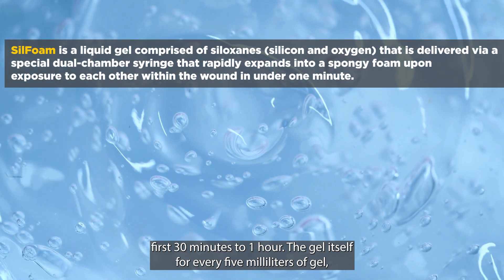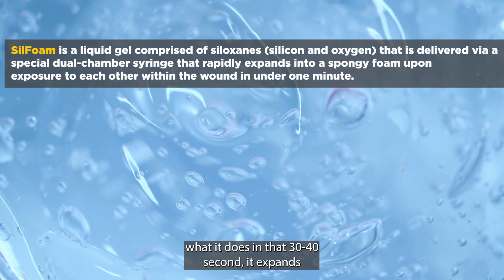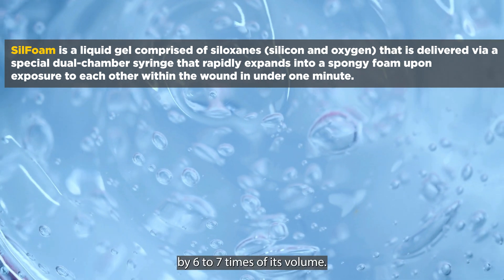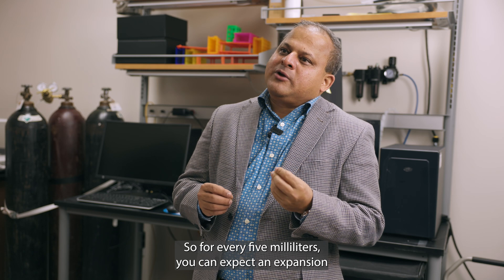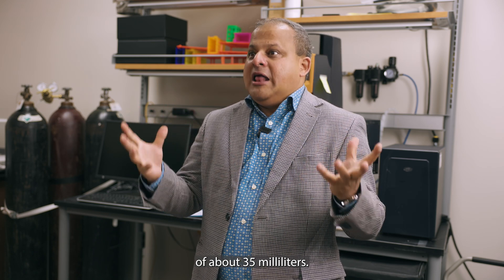The gel itself — for every 5 ml of gel, in about 30 to 40 seconds, it expands by six to seven times its volume. So for every 5 ml, you can expect an expansion of about 35 ml.